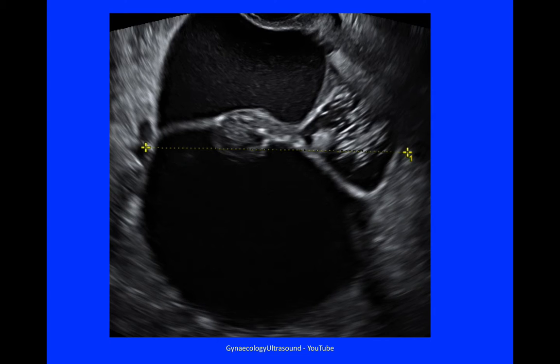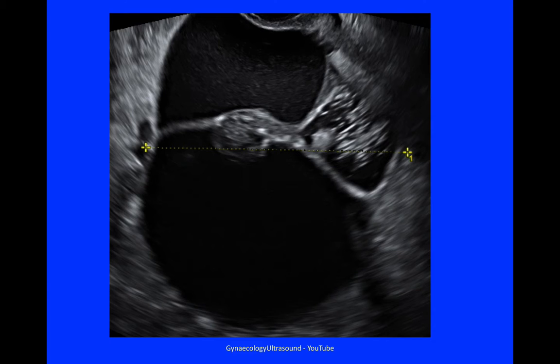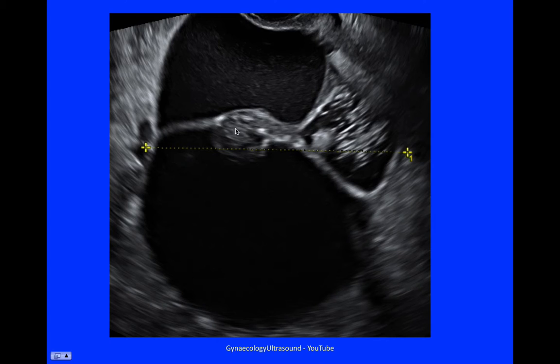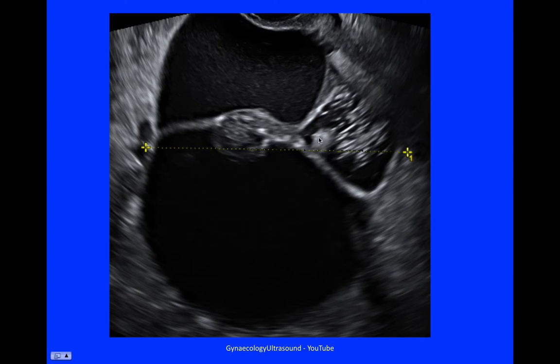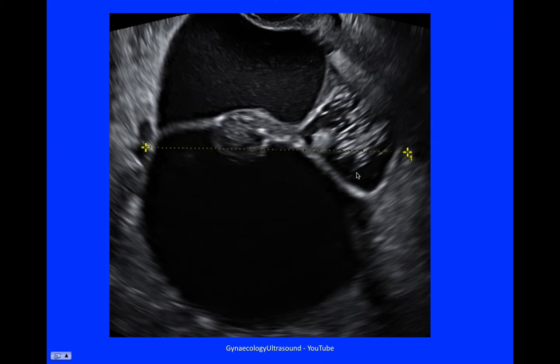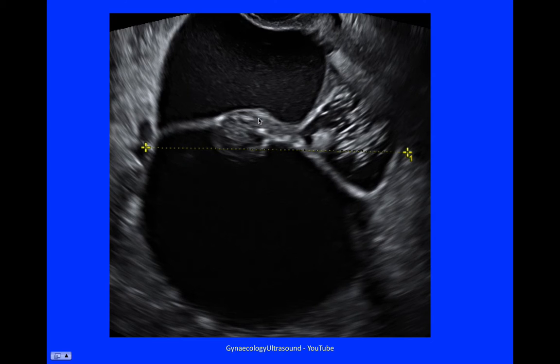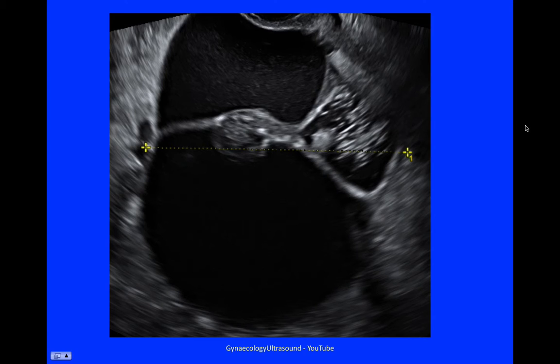This dermoid was very large, at 180mm, and it was either multilocular or multilocular solid — it's difficult to know whether that is solid material or not. The area here looks very much more like a typical dermoid, with a little Rokitansky nodule, some mixed echogenicity, and some hair likely. But the wall was irregular and it could be solid material, so I called it multilocular solid. There were no other suspicious features, and this turned out to be a dermoid.